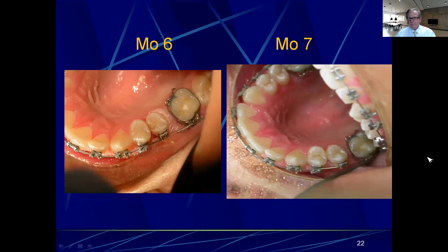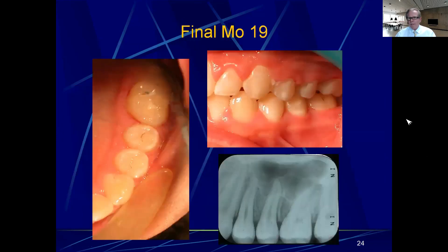Note the flexi bonding retractor — the older ones were blue instead of white like yours today, but these work so well I use them for photo retractors as well. Now we're ready to put the bracket on — there's the IP bracket you've had on the card for seven months waiting for this day. Bracket height is correct at four millimeters, and now you can get to work on the rest of the case. At 19 months: nice tight interdentation of the teeth, consistent marginal ridges, the molar has derotated back to where it was supposed to be, gingivae perfect, everything healed up nicely, and the PDL is back to normal.